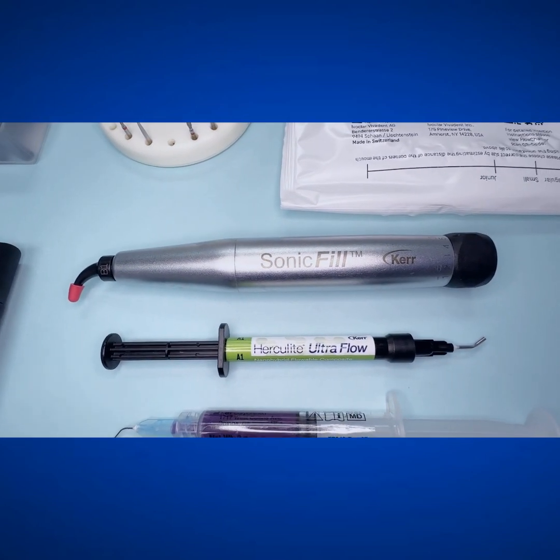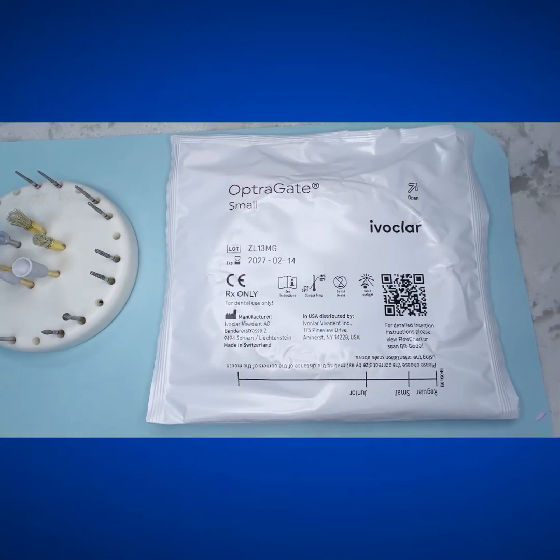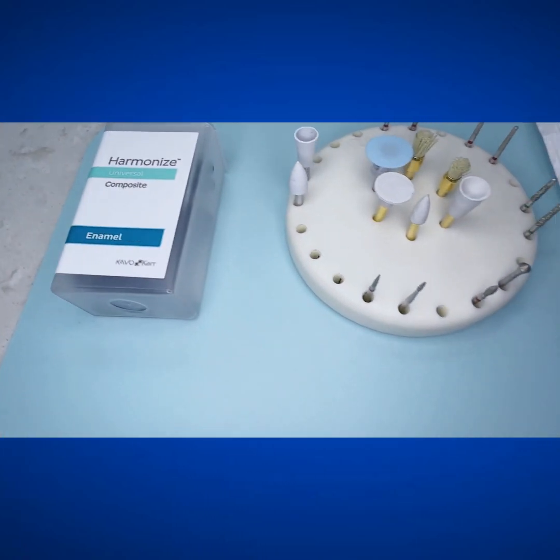Hey everyone, Doc Savage here. Thanks so much for joining. I'm going to show you how I do composite restorations using my entire Kerr armamentarium.